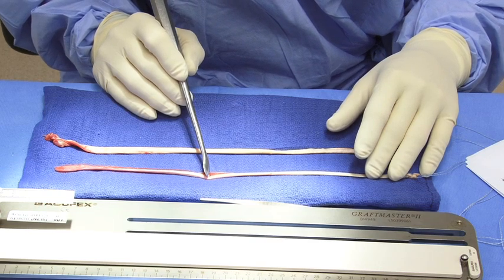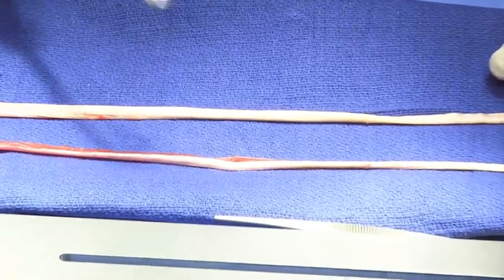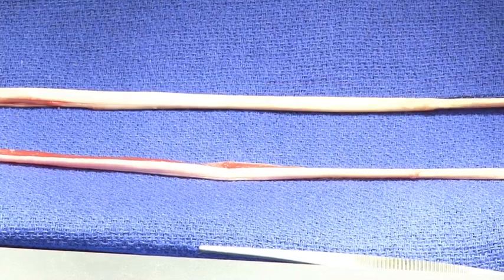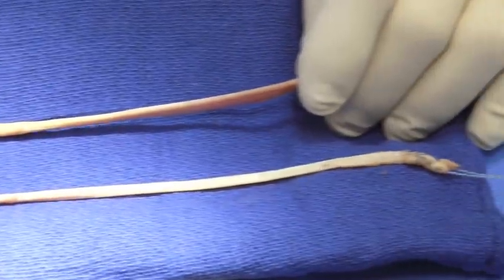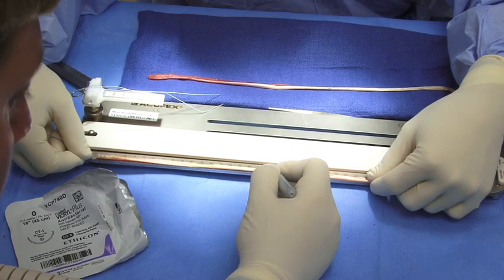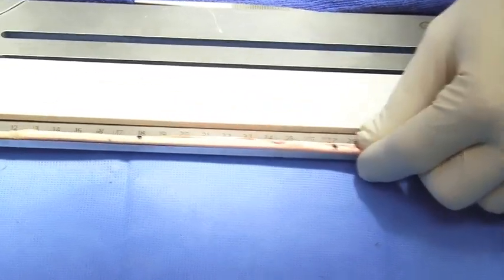Second is to avoid the routine utilization of supplemental allograft, particularly in smaller patients, and third is to utilize a technique in which the free fifth limb of the graft is soundly incorporated into the overall graft suspensory button construct. The semitendinosus and gracilis are harvested in standard fashion with a combination of sharp and blunt dissection and closed tendon stripper. The semitendinosus is assessed for its maximum adequate length for one double and one single-stranded limb of the graft, typically between 240 and 270 millimeters. The semitendinosus is marked at 18 centimeters and at 27 centimeters, which will give us a 90 millimeter graft. The gracilis is also marked at 180 millimeters.